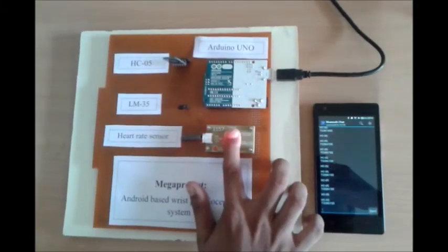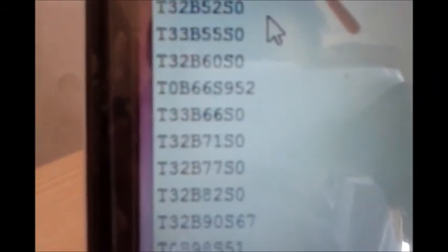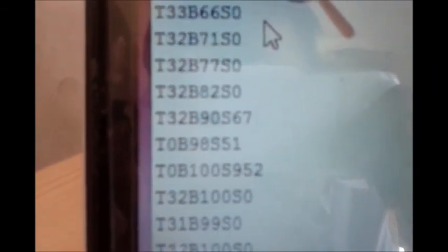And the signal, as we can see, is 0 here, and the same is the heart rate. Both are 0. The same output we can see on our serial monitor. Okay, so my friend has put a finger. So is the output, and the same is the output on the serial port. The heart rate is around 77.